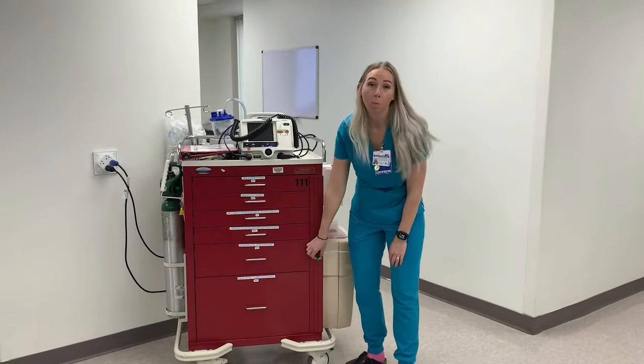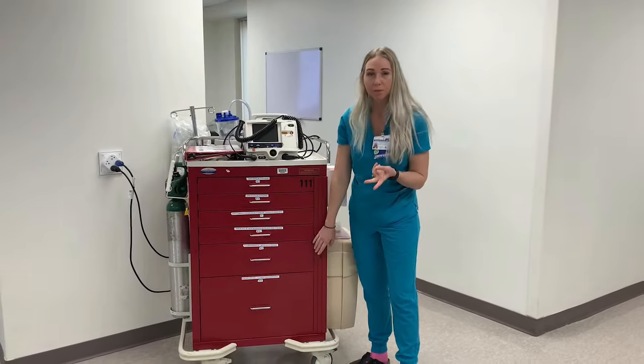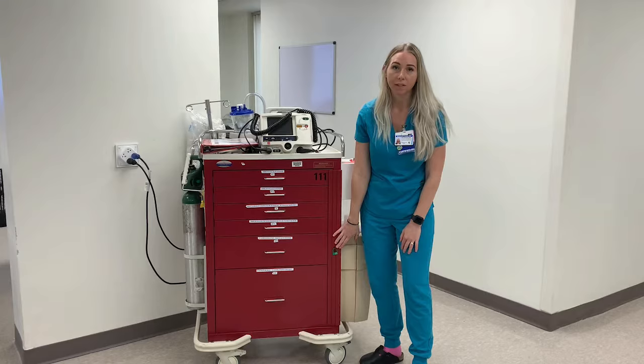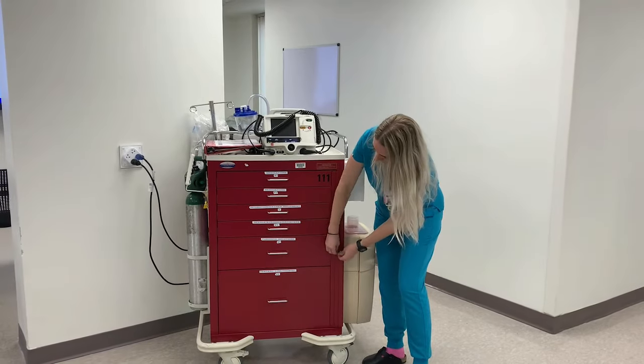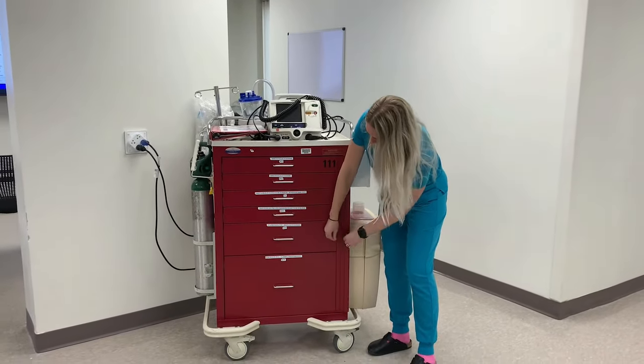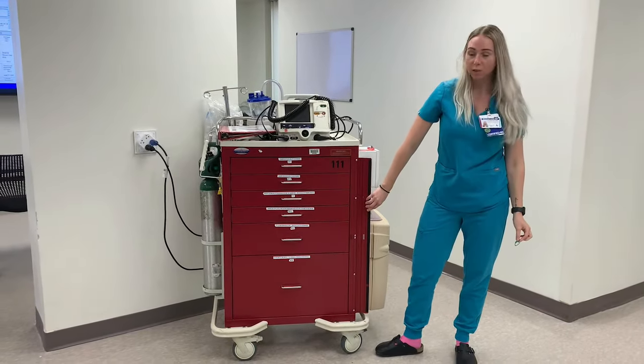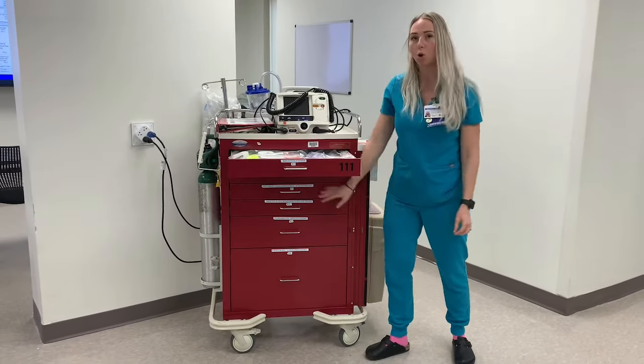I'm now going to show you how to open the crash cart. We have two different types of crash carts at our facility, and we'll be demonstrating on the first one here. This one just has one lock on the side. When you go to open it, you'll just twist the lock open and take it off like this. From there you peel open this side door and then you'll have access to be able to open all of the drawers.